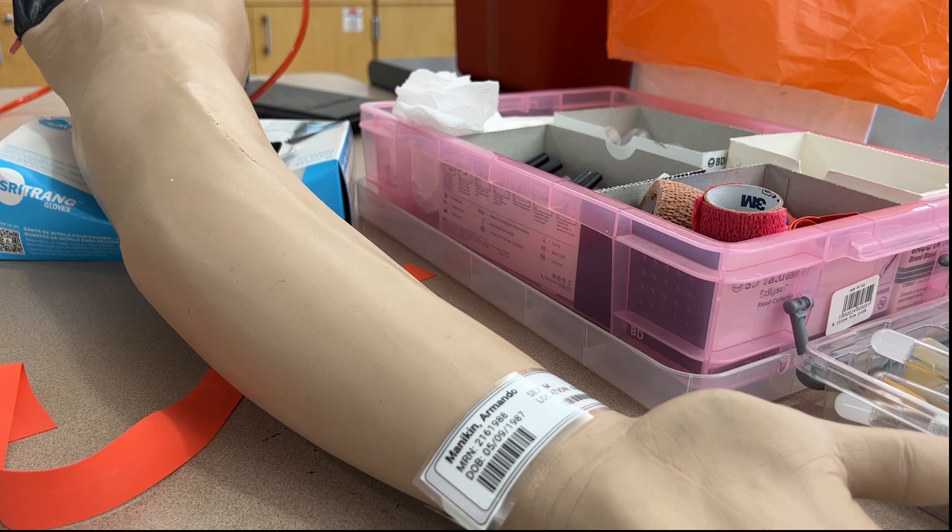In this video I'm going to demonstrate how to perform a venipuncture or phlebotomy procedure.